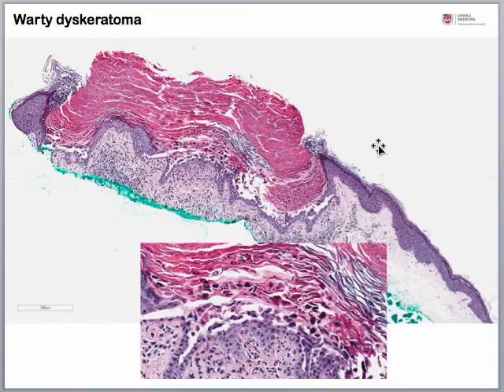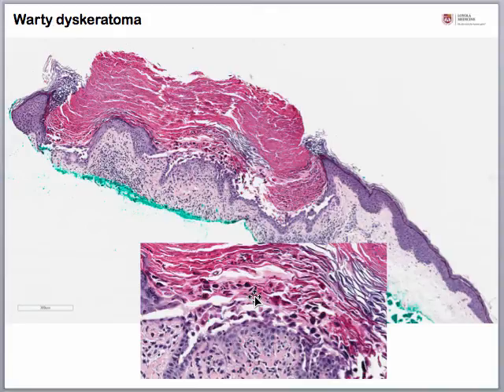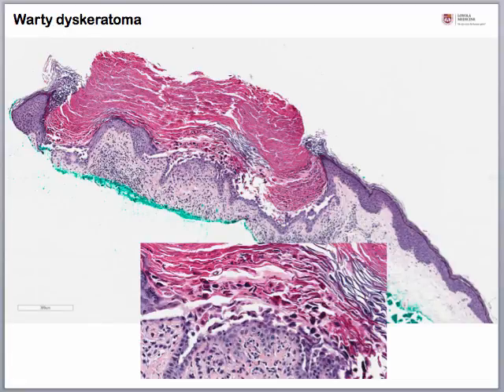Our last case shows a solitary cup-shaped lesion with dyskeratotic cells. On higher power view we can see the corps ronds and corps grains — the ronds being the round ones, and the grains being more linear ones that look like grains. A similar histologic appearance on high power could be seen in Darier's disease and Grover's disease, but based on the fact that this is a single solitary lesion with this characteristic cup-shaped feature, even under the microscope, that gives us an inclination that this is a warty dyskeratoma.